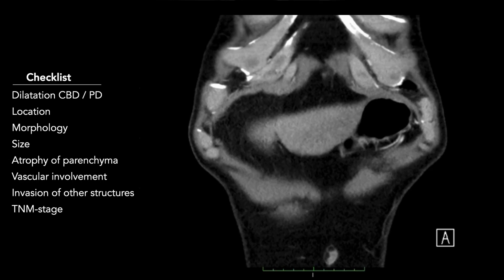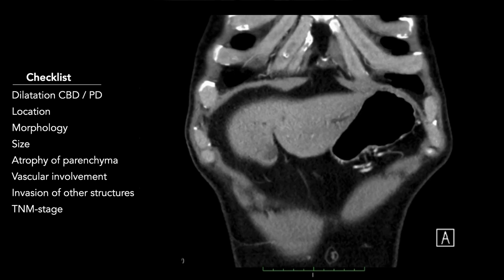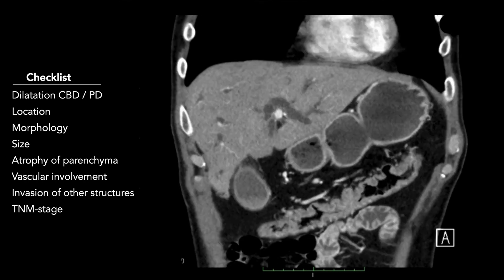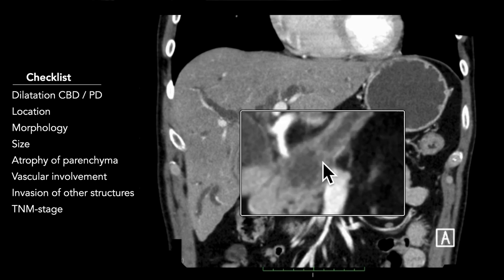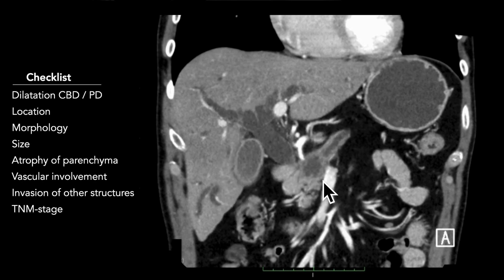Welcome to this second video lecture — a slightly more advanced case, but we will follow the same steps. For an overview, I'll show you the coronal format of the late arterial phase first. There is clear dilatation of the bile ducts, both intrahepatic and extrahepatic, as well as dilatation of the main pancreatic duct. Both can be followed up to an obstructing lesion in the head of the pancreas, next to the superior mesenteric vein.